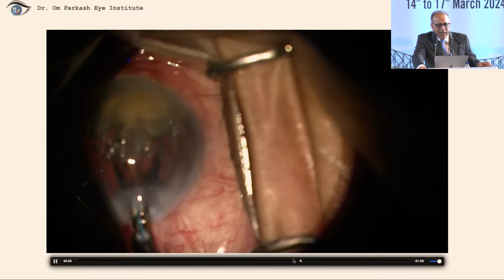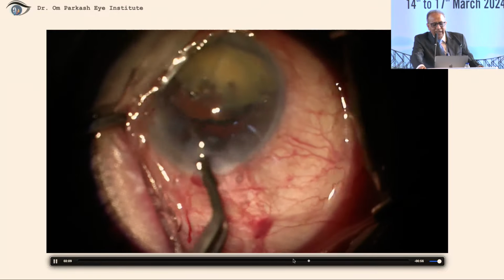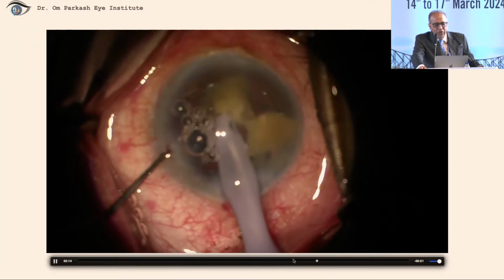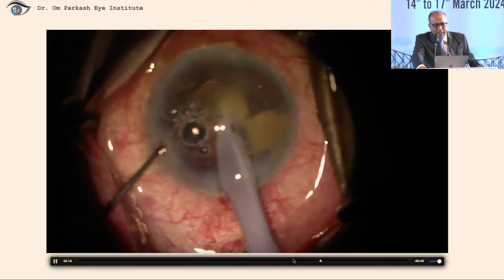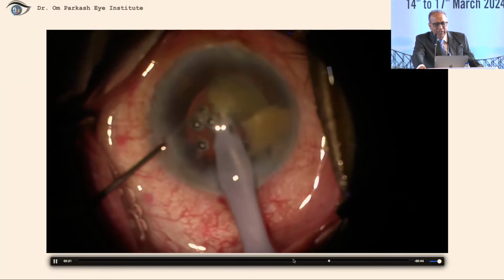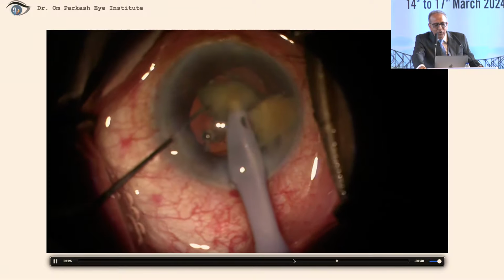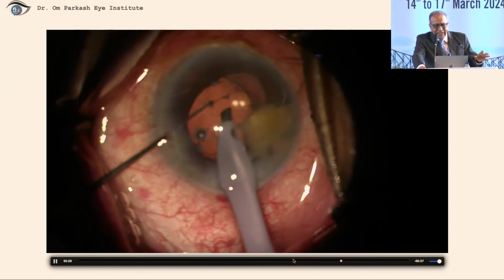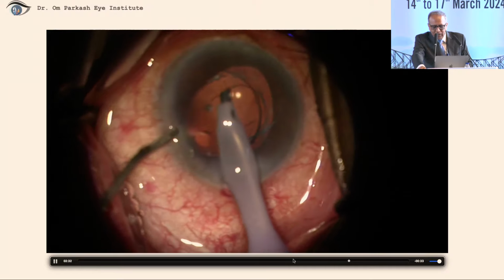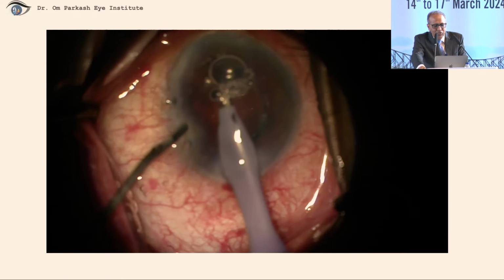This IOL as a scaffold is what Dr. Amar Agarwal has taught all over the world. It acts as a posterior capsule. Now with this IOL scaffold, you can work at a deeper plane because the artificial posterior capsule in the form of intraocular lens is there. Do slow motion. I'm not rushing into it because I'm just letting the nuclear fragments stick on to the probe, stable chamber setting, and the case is completed.